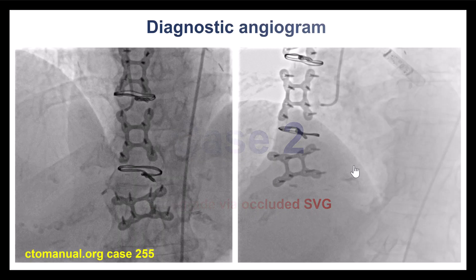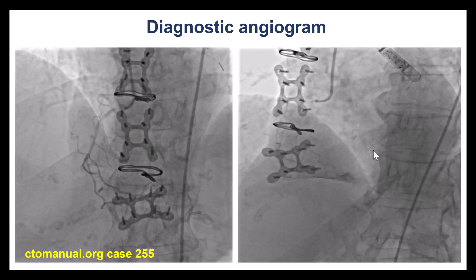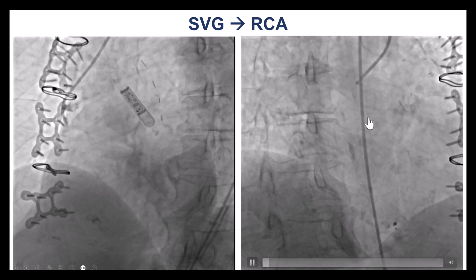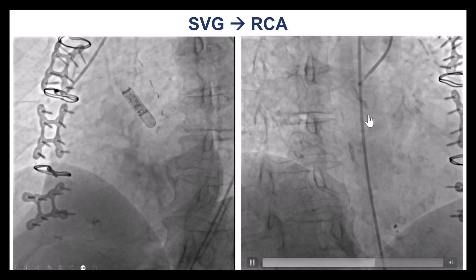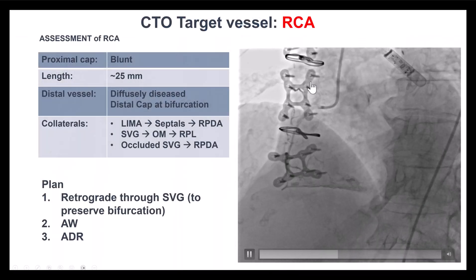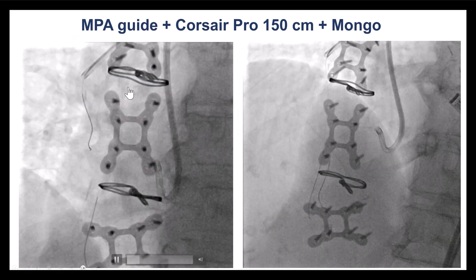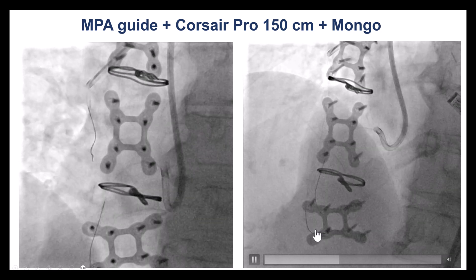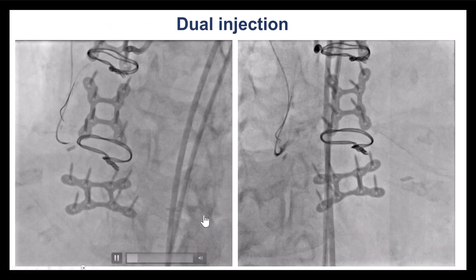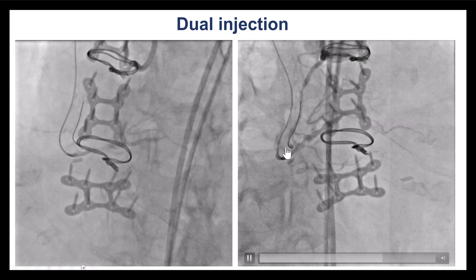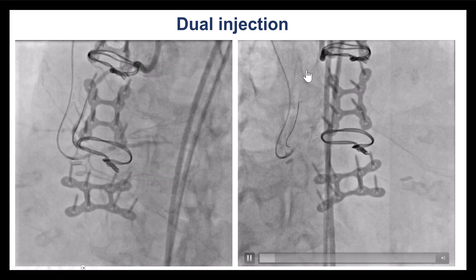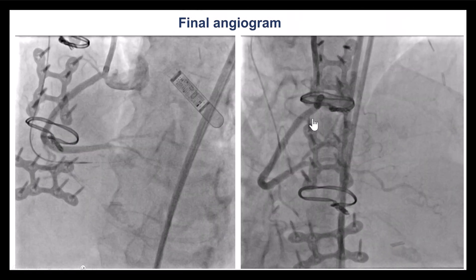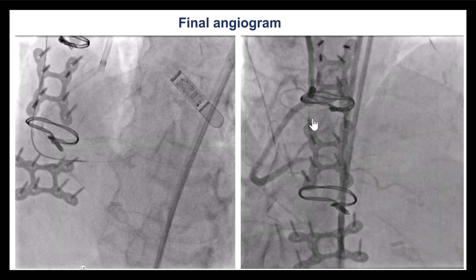This is another case showing retrograde through an occluded vein graft — an example of a right coronary artery CTO. The saphenous vein graft is occluded but has a nice entry to it, so presumably this is a relatively fresh occlusion. We tried to go retrograde through the saphenous vein graft, using a Corsair along with a Mongo polymer-jacketed wire that advanced nicely all the way down to the distal anastomosis. Once we delivered the wire and microcatheter, we did a dual injection through the microcatheter and through the occluded RCA guide, and were able to advance the microcatheter and wire retrograde. The final angiogram shows successful recanalization of the native right coronary artery.